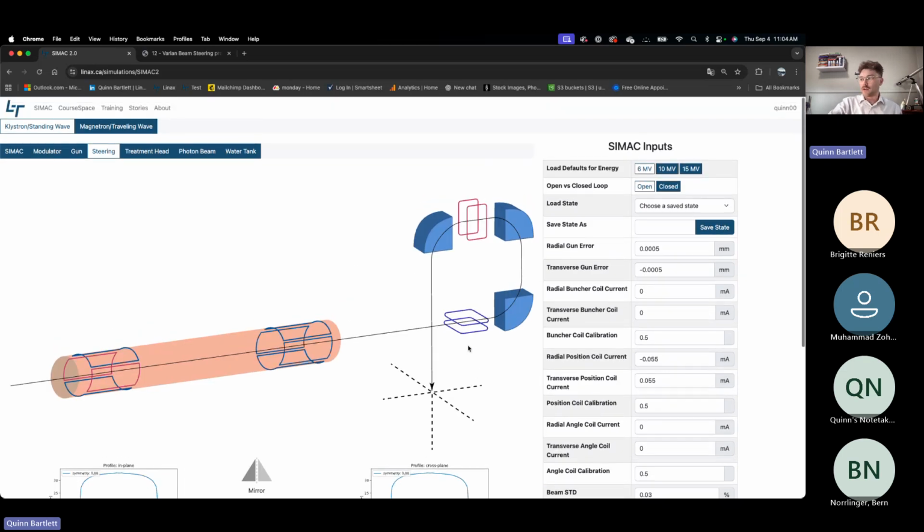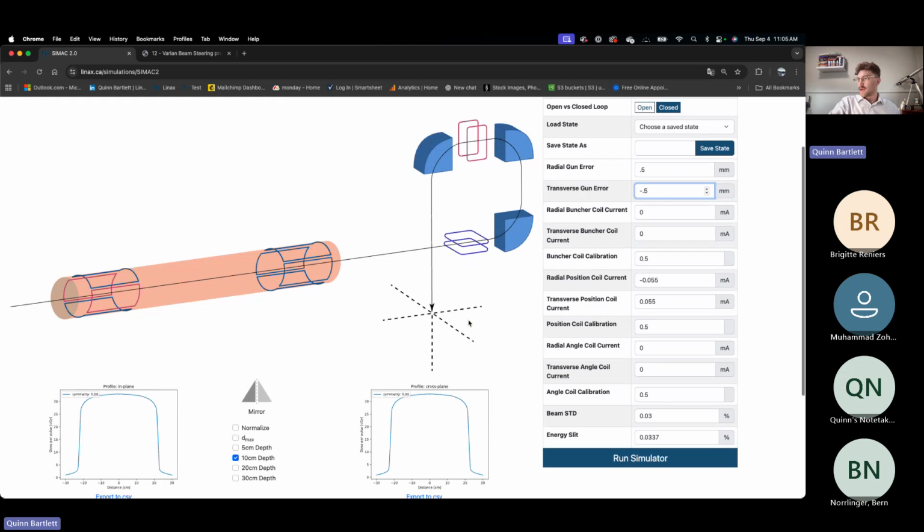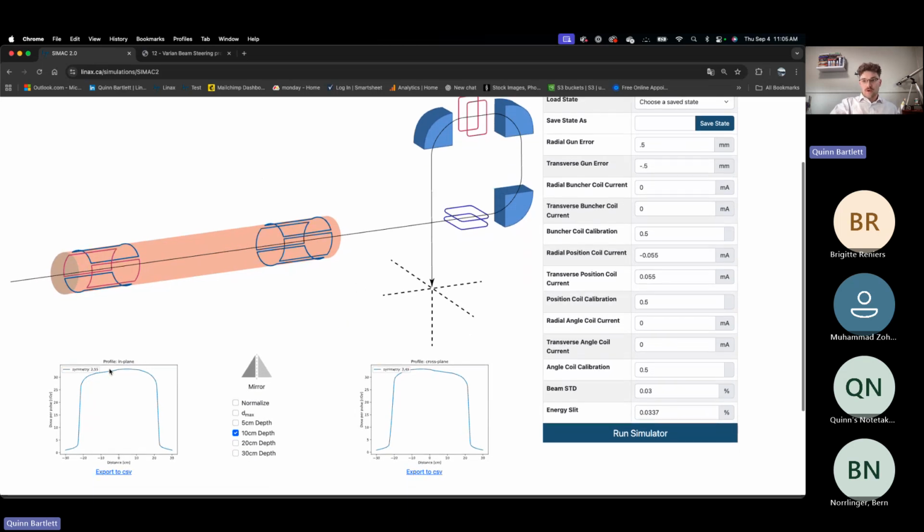If we want to run some asymmetry, I'll introduce both a radial and a transverse error. We'll do around 0.5, and I'll do minus 0.5 in our transverse, just so it goes the other way. Around the 0 to 1 range is where we want to introduce our error. It creates errors that we can see physically, but not errors that are too big, which would be too much asymmetry to investigate, or a little out of the norm of the clinic, right? So we introduce an error, and we get a pretty bad asymmetry here in both our in plane and cross plane profile.